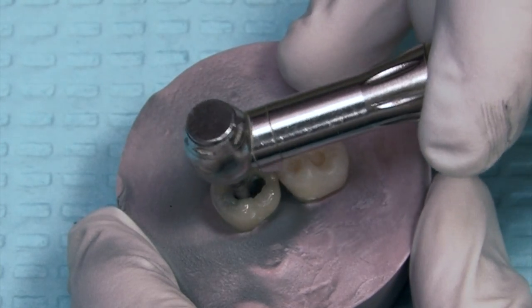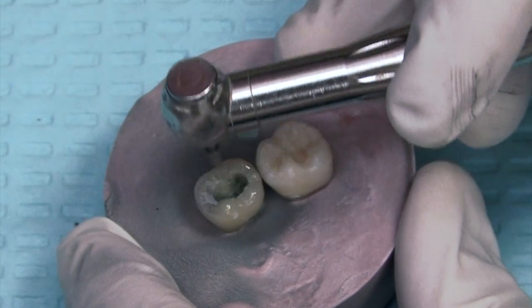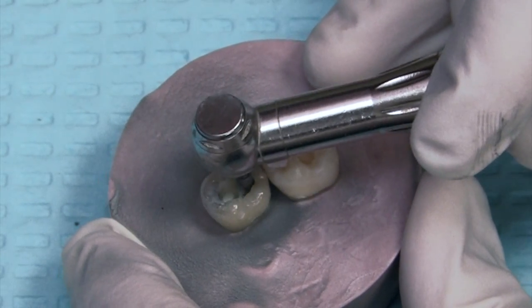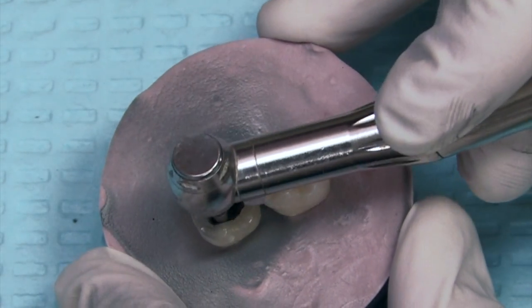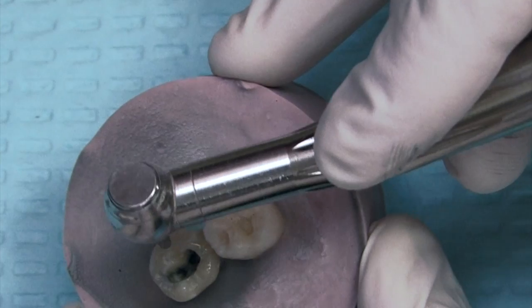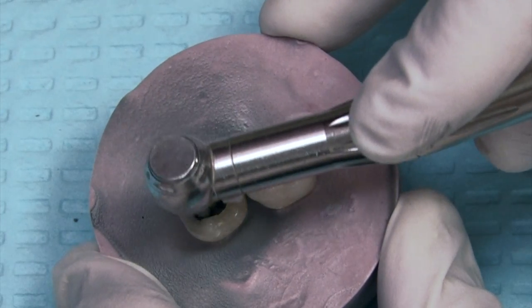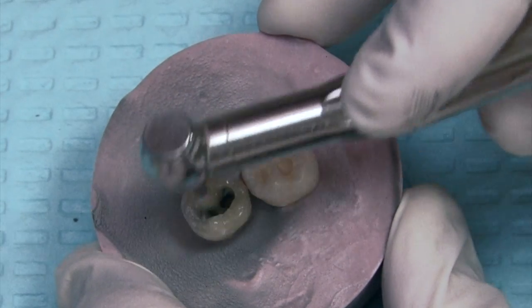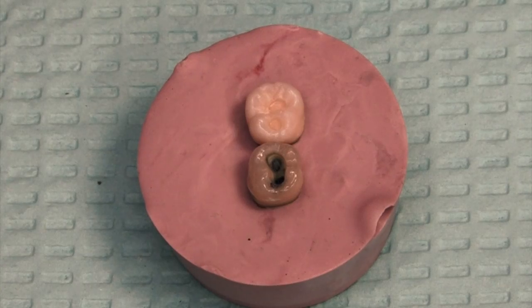Of course, we get down to the deeper areas. A lot of times these amalgams will leave behind a dark dentin stain, and I'm not going to concern myself with removing that — only if it's decay will I remove it. Most of the time I can get all the decay removed with just a high speed handpiece, but I will use the slow speed when the decay gets pretty deep and close to the pulp chamber. When I think I'm getting to the point where the decay is all gone, I'll apply a little extra pressure just to make sure all the decay is removed.